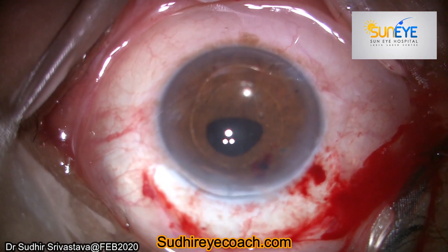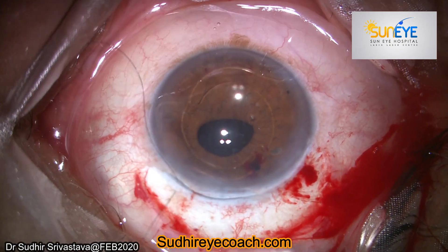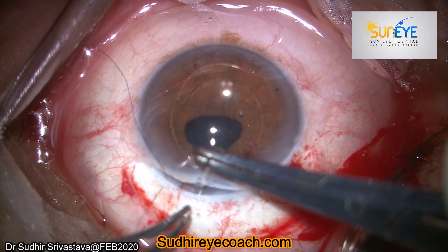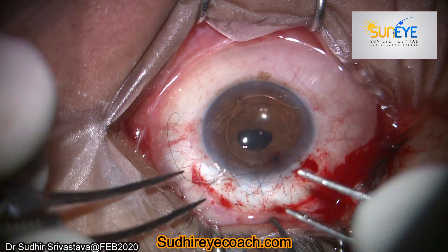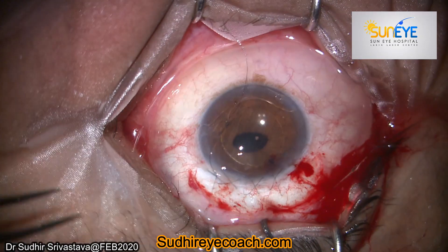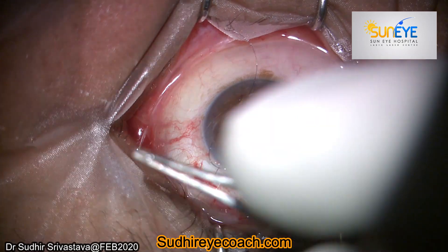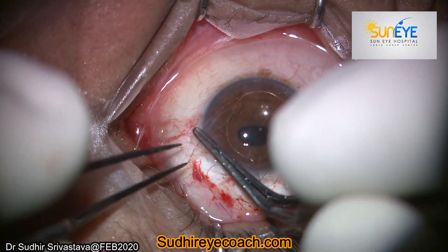I always maintain a library of these emergency lenses, so without any problem I implanted the AC IOL and checked whether the haptics are at the angles or not. Then finally I closed the wound through shoelace suturing. If you are doing regular surgeries, one day you will have to face such situations — however, the patient is dependent on you and you are the final authority to make decisions in the patient's benefit.